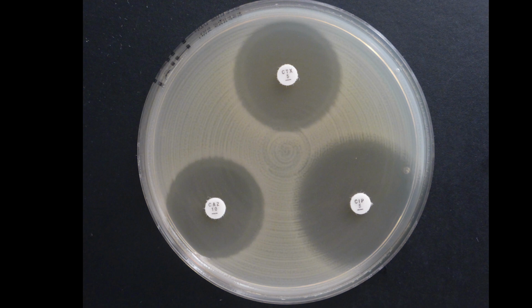And we know from having performed reading exercises in many different ways, both in our own lab and also when we have had practical courses, that it is possible to standardize reading within ±1 millimeter among 15 to 20 people when you have a reading exercise like that. So that should be the aim, having a zone diameter within ±1 millimeter of each other.